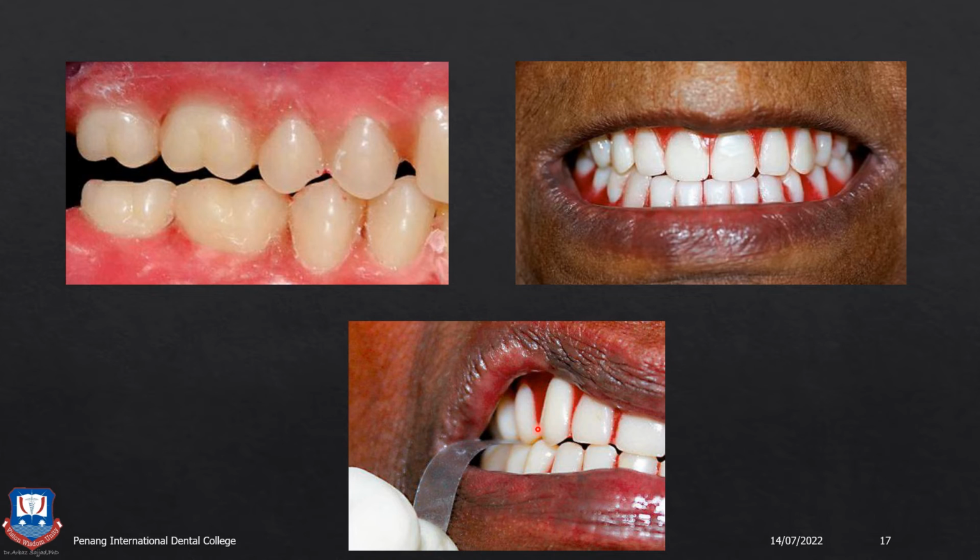Many times the teeth may appear from the outside to be occluding with each other because of saliva and all these things, but they may not be in contact, and later the patient may complain of instability of the denture or inability to chew soft food on that side. So on both sides you should have a similar pressure of occlusal contact. This can be checked with the articulating paper or a shim stock.